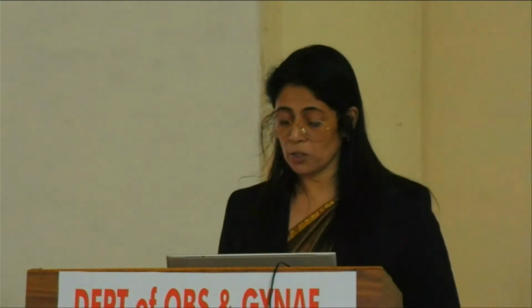I have 2 cases. One turned out to be an amniotic band syndrome, where we see there was a thin band. But amniotic bands are usually thin, you have to increase the gain. Whenever we see limb defects, we always have to look for amniotic bands and try and increase the gain. And here we see that there was a band from the amnion, which was causing disruption of the vascular supply, as a result of which part of this limb was missing, and this was very well seen in 3D.